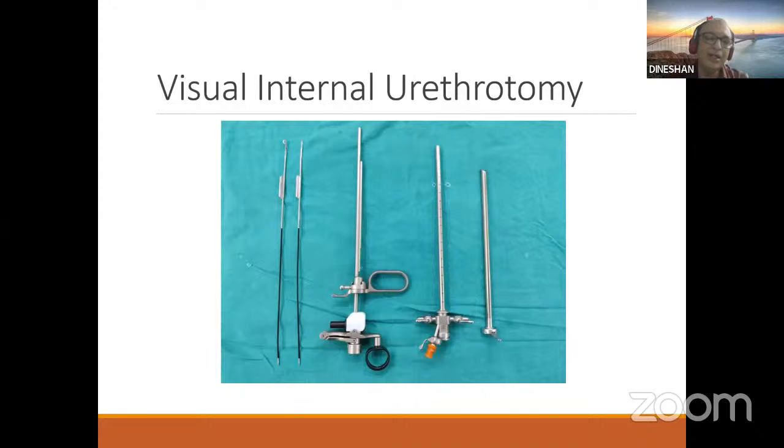If the bladder neck is very stenosed, you may not be able to introduce even the cutting knife, so while you are passing the knife into the bladder through the orifice itself, it will cut. Both forward and backward movements will cut the stenosed area. That is used for bladder neck incision.